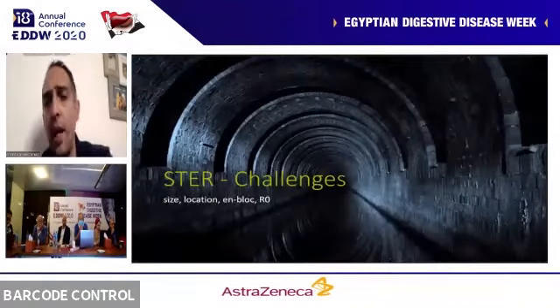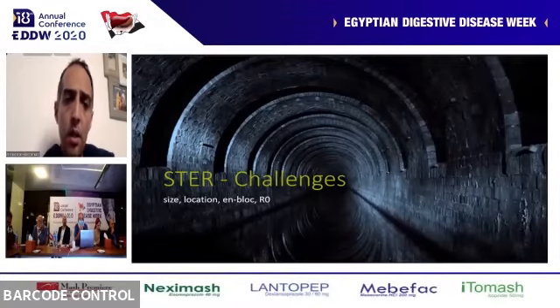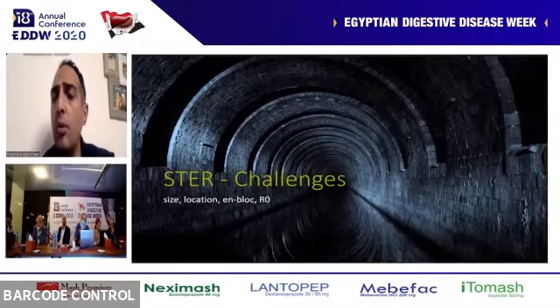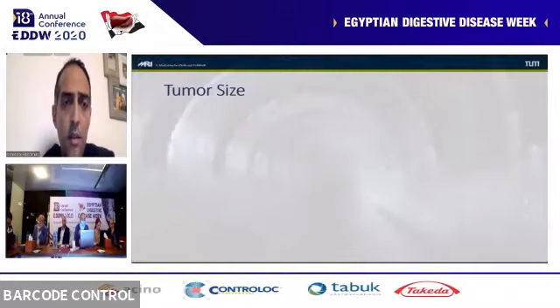So the challenges, like learning any technique: first of all, we have to know the indication, how to perform it, how to do the post-operative care, and how to manage the complications. So the first challenge that we have with this technique is the tumor size.